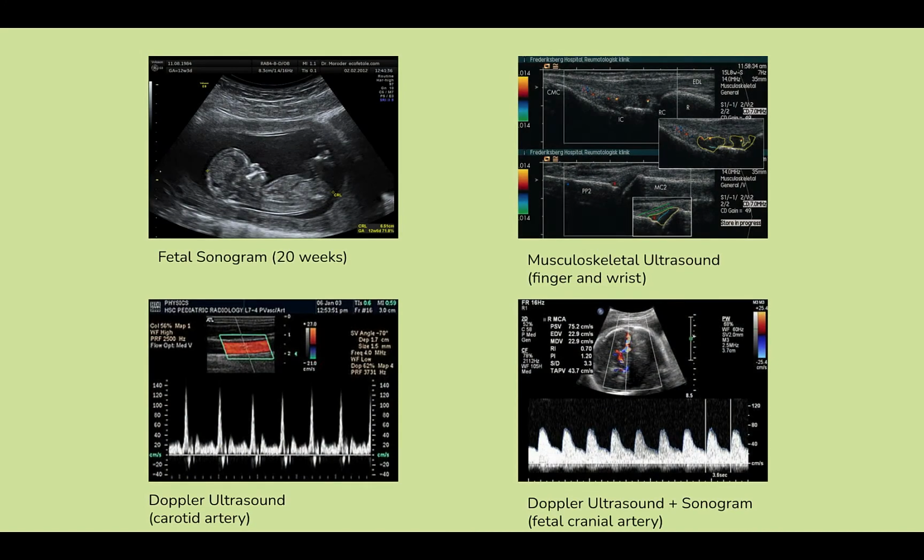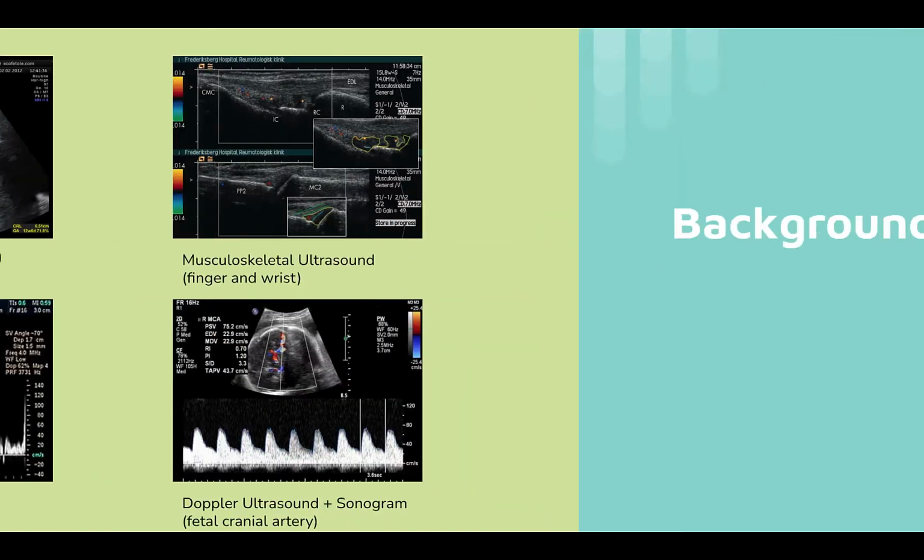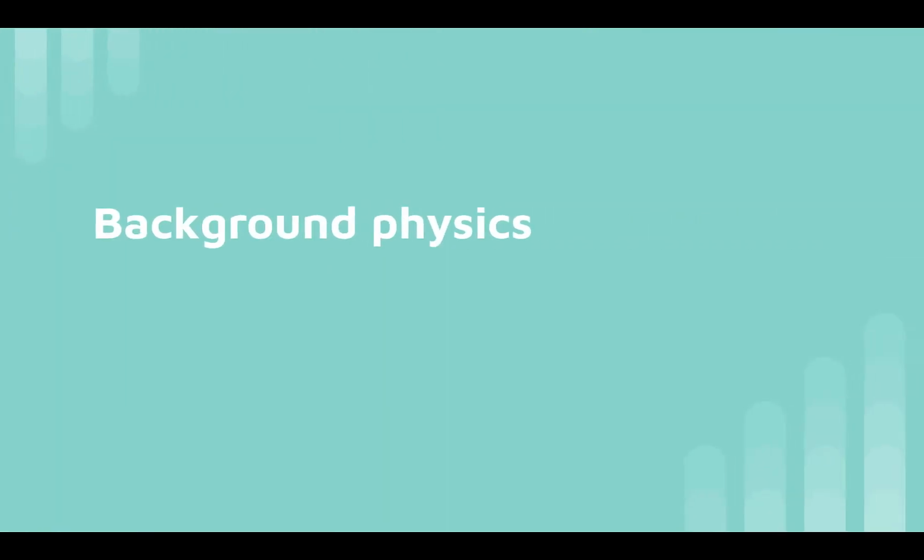There are multiple forms of ultrasound tests that produce varying types of images or graphical representations. For example, ultrasound can be used to obtain the speed and direction of blood flow within various blood vessels, or, perhaps more familiarly, ultrasound can be used to produce images of a growing fetus during the gestational period. The transducers use different physical equations to produce different types of images.